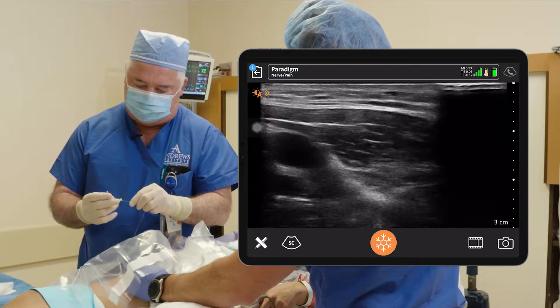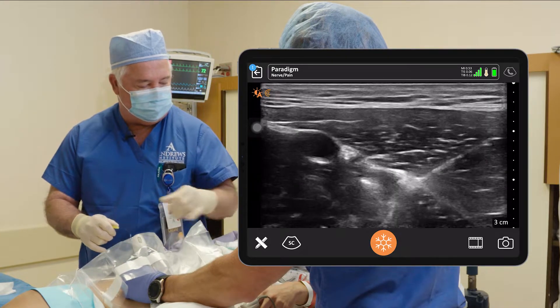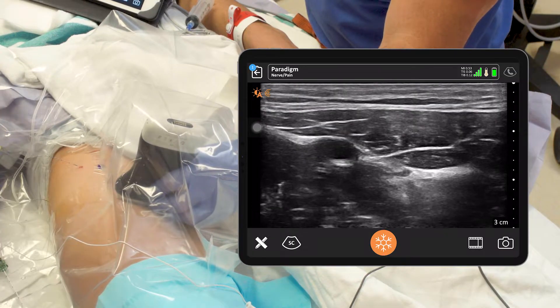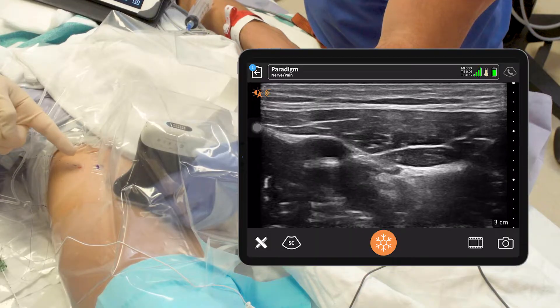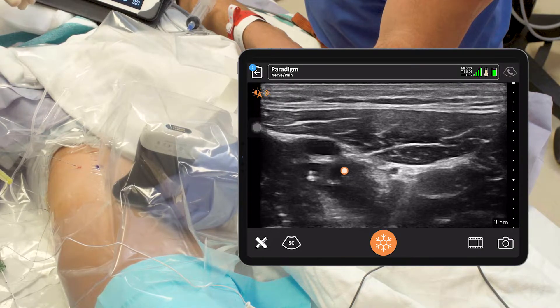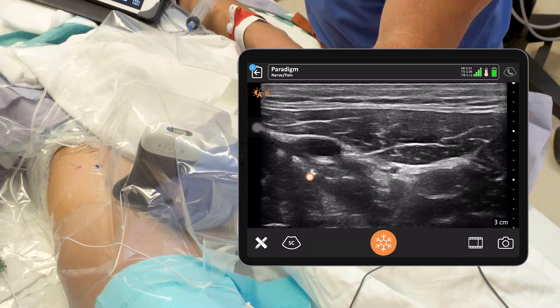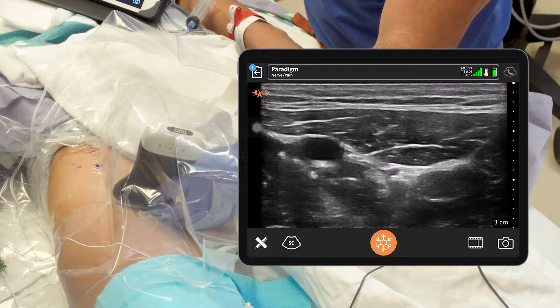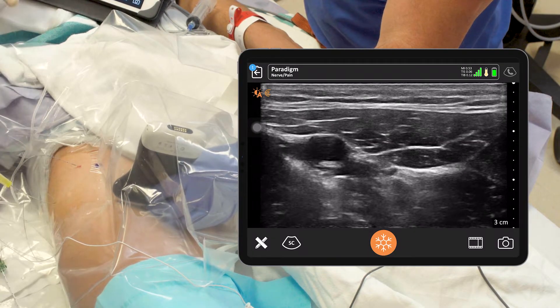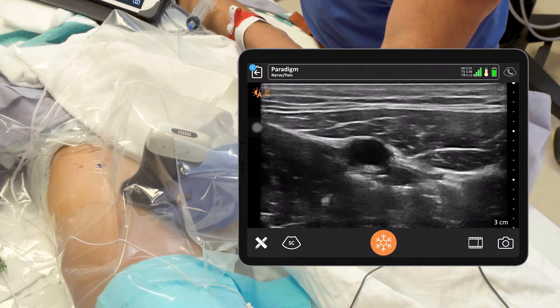Let's put our alligator clip on here. You can see the catheter right there on the ultrasound image. Rocky has gone down the leg with the probe since we put the catheter in, and we threaded it down, so we're going to see the spread down here. You can see it over there under the artery — a little air. Let's put just another touch of air in there. You can see the spread of the local right in there under the artery, so it's going to open up the space where the saphenous nerve and the nerve to the vastus run. Should have a good block out of this.